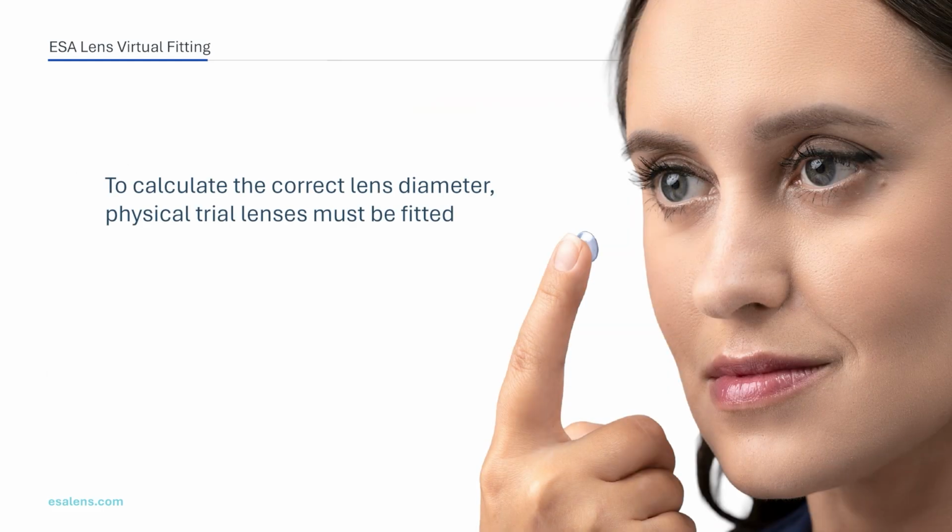Regardless of the method used to determine the corneal center, it is unfortunately impossible to calculate the correct lens diameter with sufficient accuracy using topography. Consequently, physical trial lenses must be fitted for this purpose.